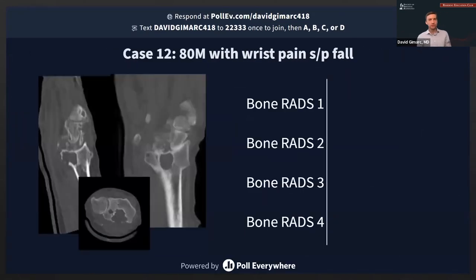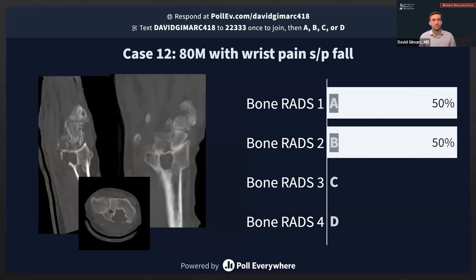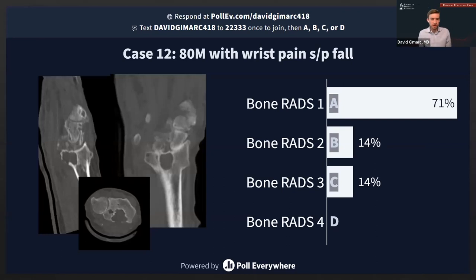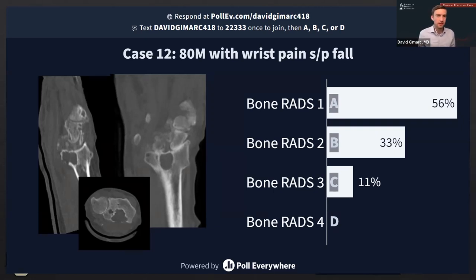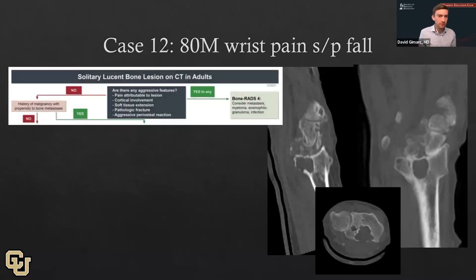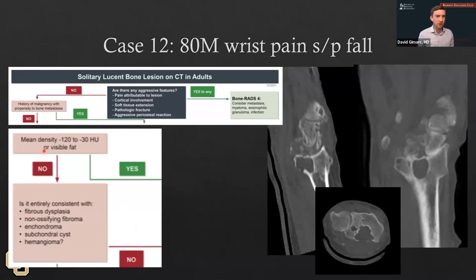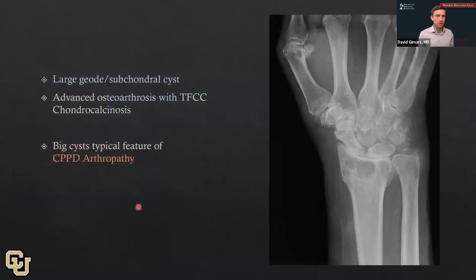Another case: an 80-year-old male with wrist pain after a fall. Some think it looks pretty good, some would like more imaging, a radiograph would be good here, and some would follow this up as Bone RADS 3. This is a solitary lucent lesion in an adult. It doesn't really have any aggressive features — a little thinning but that's really a much more isolated finding if you scroll through. It doesn't have intralesional fat, but it is consistent with a subchondral cyst. Here's the radiograph: a big geode or subchondral cyst in a wrist that clearly has advanced osteoarthritis with a lot of TFCC and chondrocalcinosis. When we see these cysts in the setting of chondrocalcinosis, this is a really good sign for CPPD arthropathy.